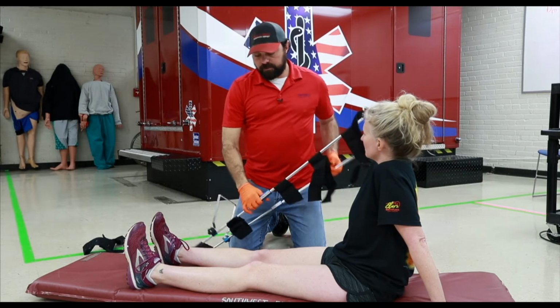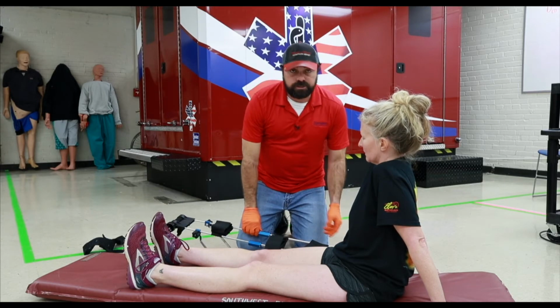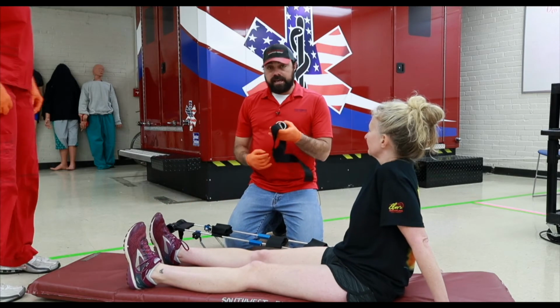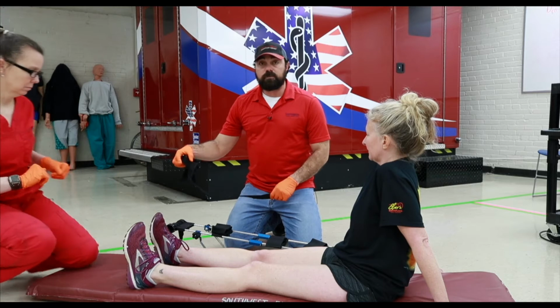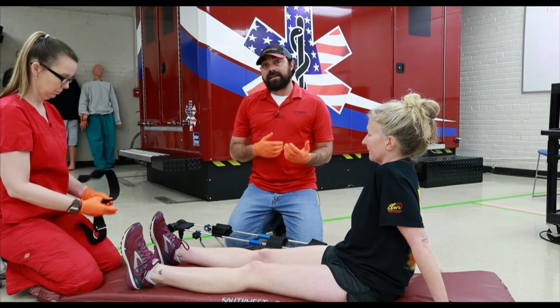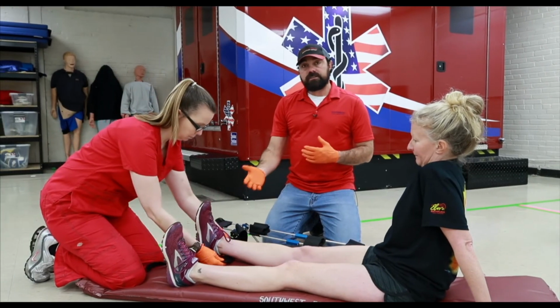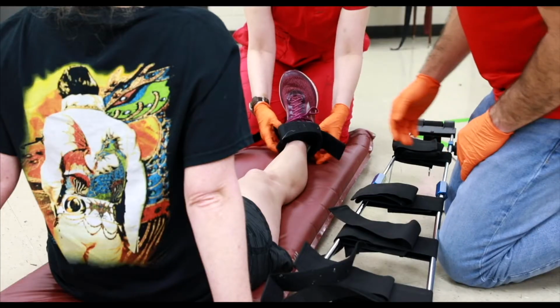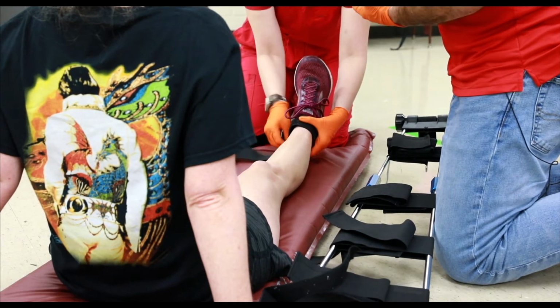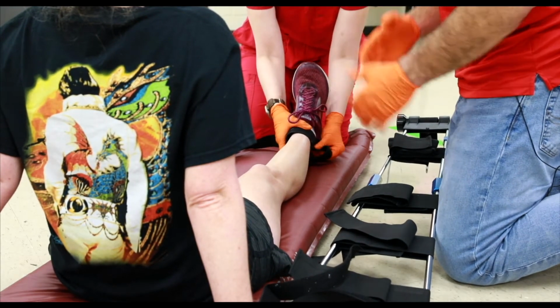So when you first come up to the patient, of course you know what your injury is. You have your partner come in, and they can use the ankle hitch if they have it readily available to them, or they can use just their hands. And what you want them to do is hold and maintain manual traction of that extremity. And while they're just pulling gently back, you don't have to really tug hard. It's just enough traction, like I said. You're pulling just hard enough so that you can relieve the pain.